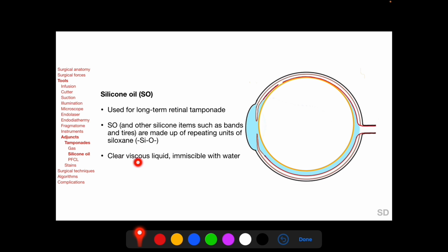Heavier than water silicone oil, or heavy silicone oil, can provide inferior tamponade, as shown here in this diagram, and can be produced by introducing trifluoropropyl side chains on silicone atoms, which are called fluorosilicone oils, but they have a high incidence of early emulsification and significant intraocular inflammation.